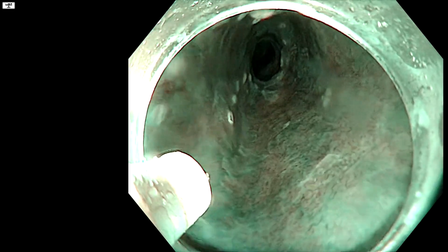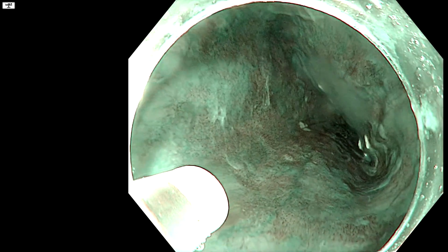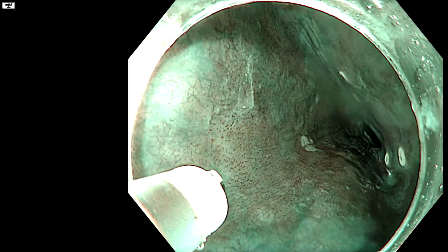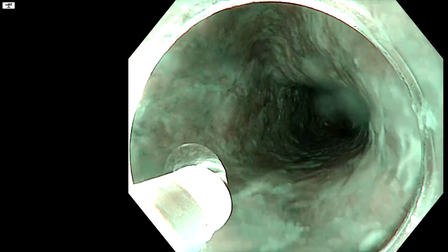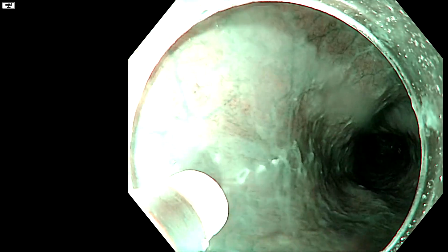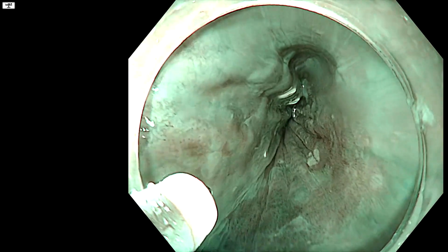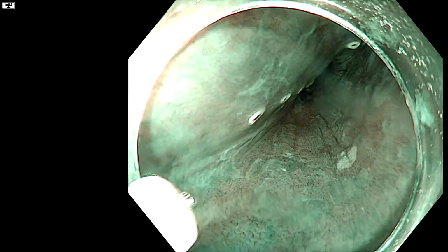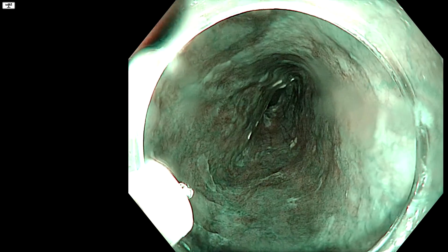And then we need to think about where this thing is coming to north of here. I think probably the main area of abnormality is ending around about here. So we probably, it's very difficult. It's very difficult, and you could say, okay, well actually I need to come up this whole area when you start to look at it like this. And this does often happen. So when you're doing this, and I guess real life, you often see something which you think, okay, actually that changes what I want to do.